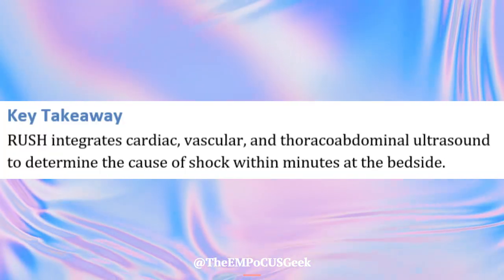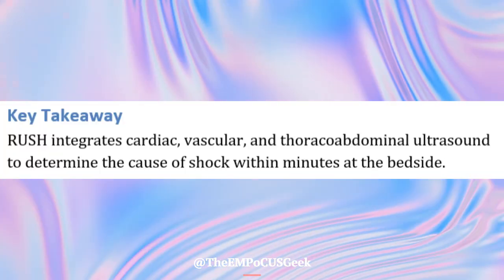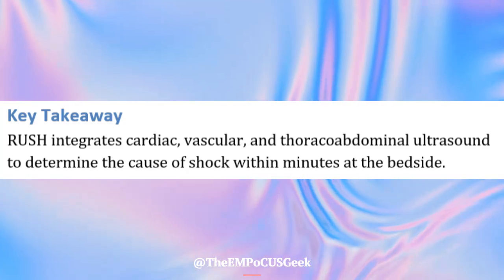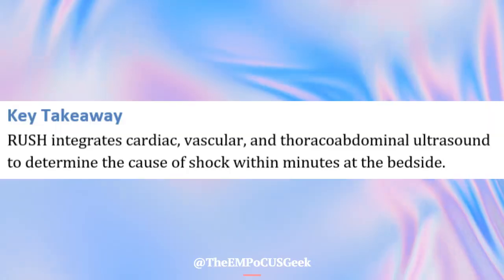The key takeaway is that the RUSH protocol integrates cardiac, vascular, and thoracoabdominal assessment to guide immediate management at the bedside.